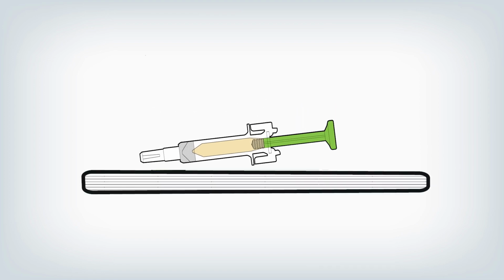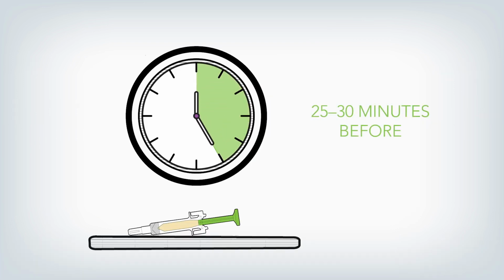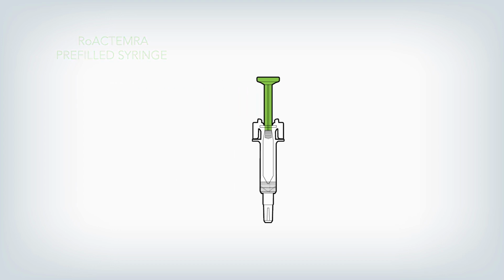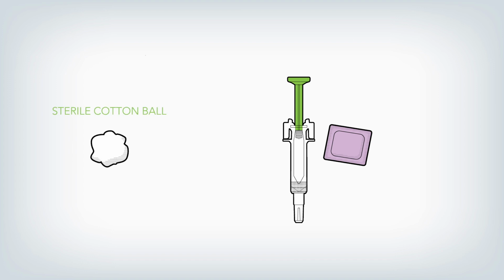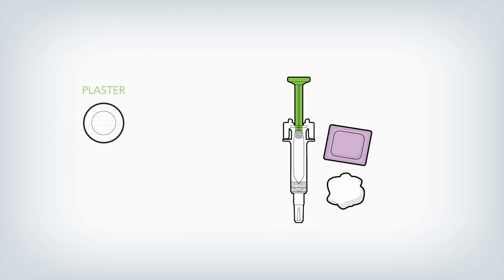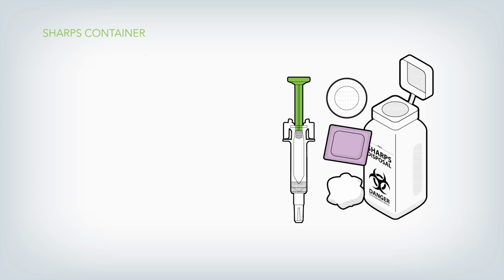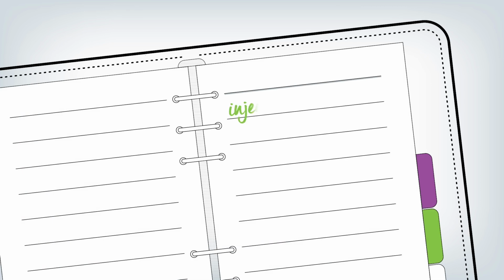Now place the prefilled syringe on a clean, flat surface, out of the reach of children, and wait for 25 to 30 minutes while it reaches room temperature. While waiting for the prefilled syringe to reach room temperature, make sure you have everything else. An alcohol pad, a sterile ball of cotton wool or gauze swab, a sticking plaster, a sharps container for disposing of the needle cap and used syringe once you have administered ROACTEMRA, a treatment diary and a pen or the diary app. You should always write down the date of your injection in a diary or record it in a diary app and make a note of the injection site.